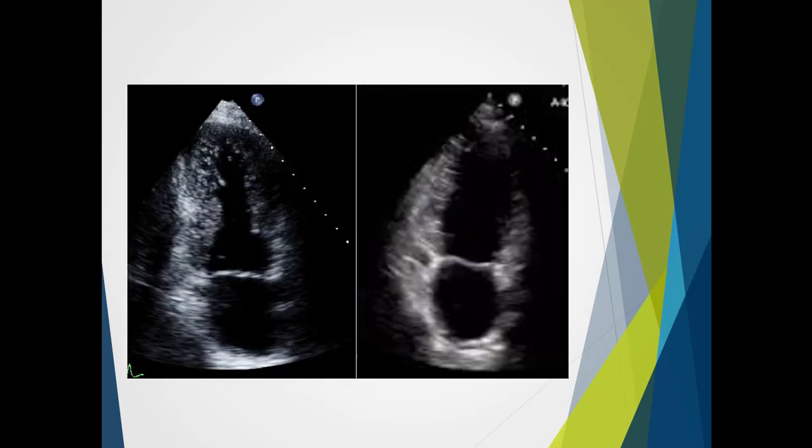And here we have an example. So we can see both papillary muscles associated with the true commissure view. In this instance, we'd see the medial portion of the posterior leaflet, the middle portion of the anterior leaflet, and the lateral portion of the posterior leaflet again. Then by rotating counterclockwise, we obtain the true inferior wall and the true anterior wall.